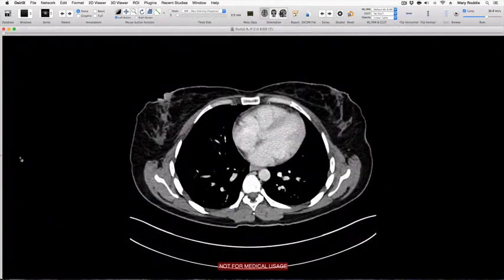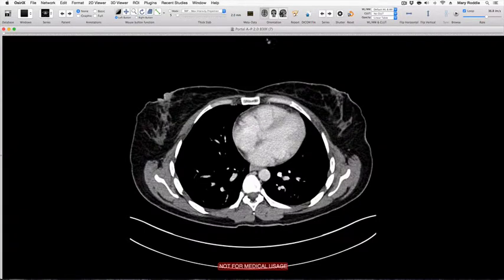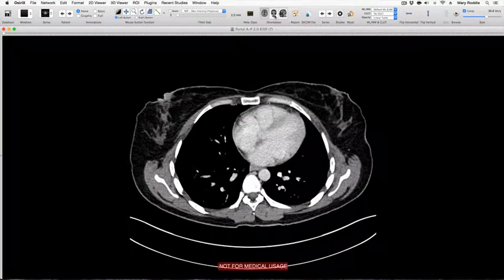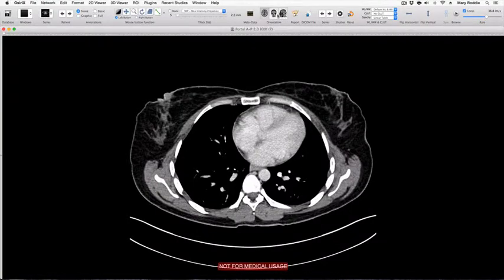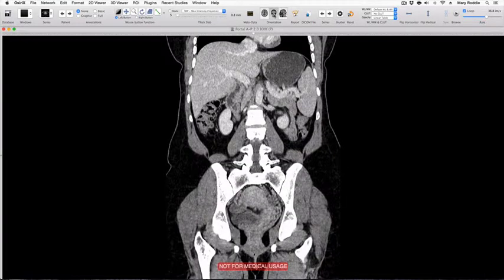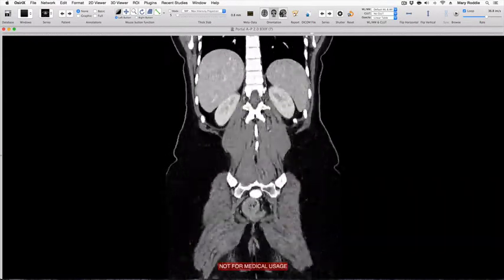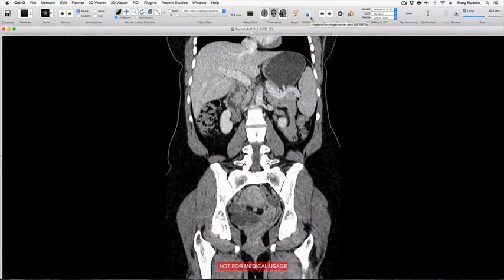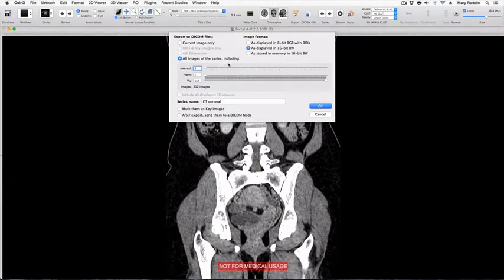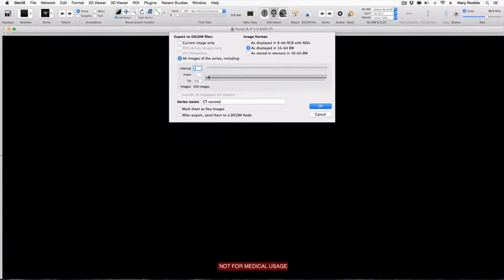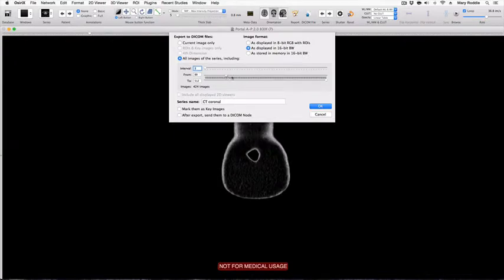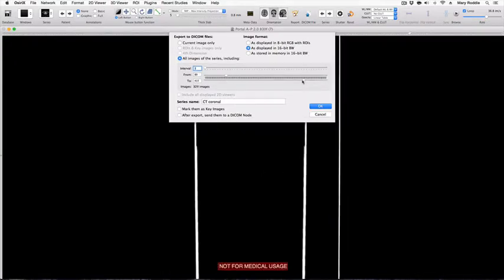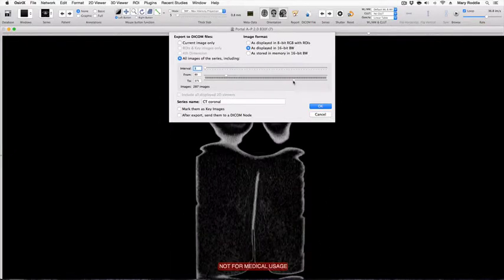To make a coronal series you need to go to your original data set and select the orientation button on the toolbar. This is the coronal reconstruction and this is the sagittal reconstruction. If we hit that button we can see our coronal reconstructions in high quality. To export a coronal series press Export to DICOM, select all images of the series including, and for coronal series you will need to prune a lot of images from the front of the patient and from the back of the patient. That has reduced the image series down to 287.